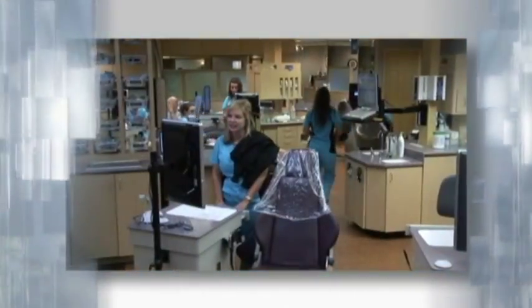Getting patients started on Vivera is a simple process, freeing up time for dentists and other office procedures. At the initial Invisalign consult, we start talking about retention and we talk about Vivera retainers specifically as a means of retention.